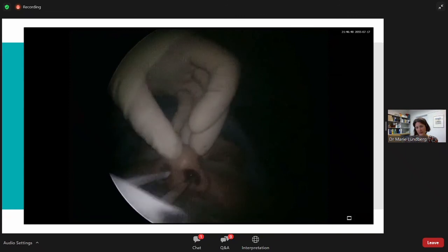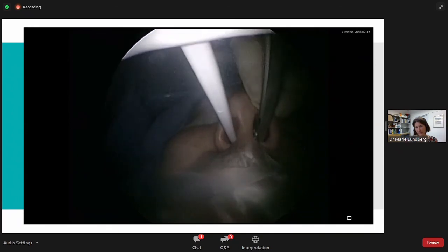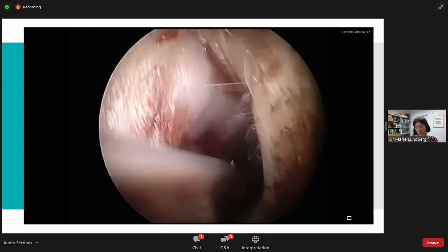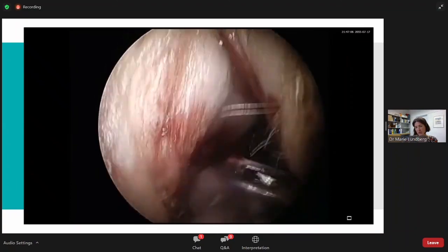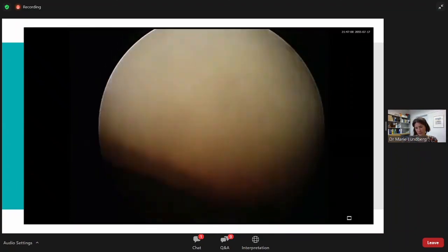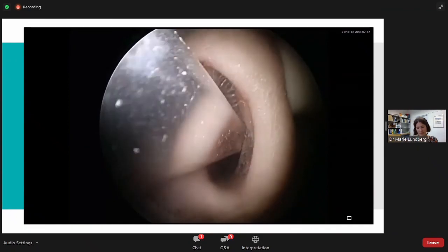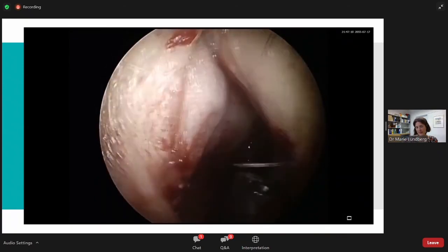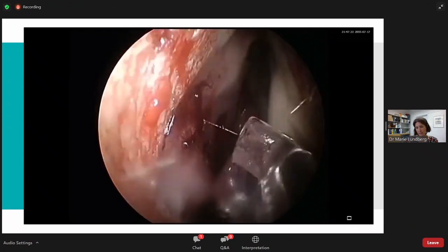And here's a video. It's not the best one. This is my colleague who puts it in. You saw that she put in the staples without any speculum or anything. It just went in the nose, and then she staples. She doesn't turn it around. She staples the frontal part first. I don't think it matters what part you start with. It's just maybe easier to fix the flaps in the anterior parts first, so that you see the posterior parts better.